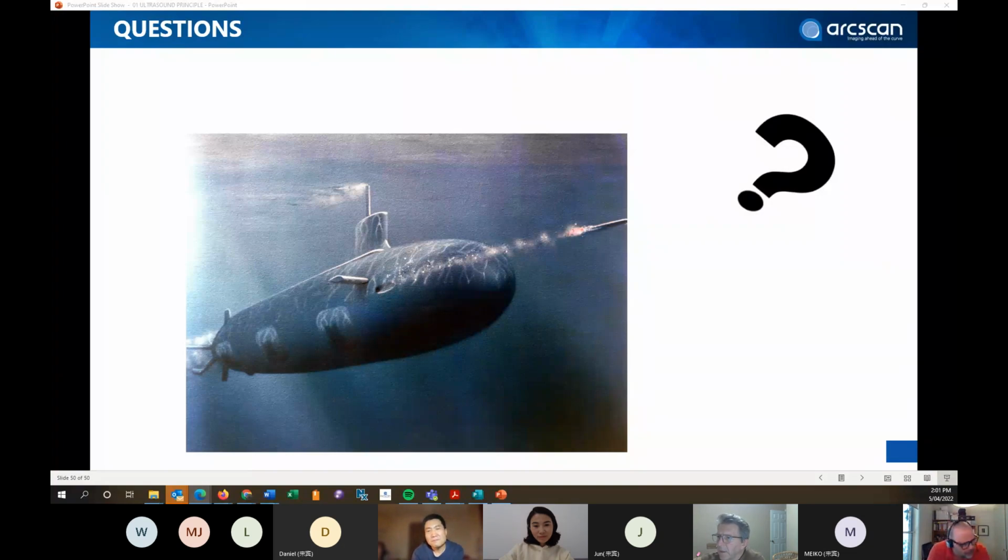No, I haven't. The OCT works with a reference mirror, and OCT has around 3 to 5 microns resolution in the retina. The problem with OCTs is they lose focus when they are in the anterior segment because they're optimized for the back of the eye, and that's pretty much what's happened there.